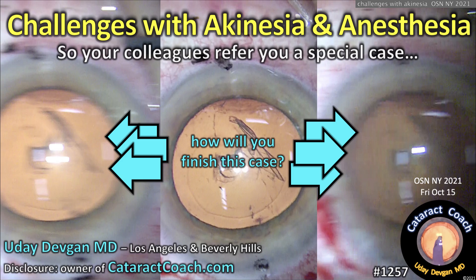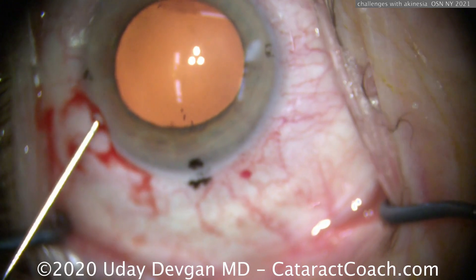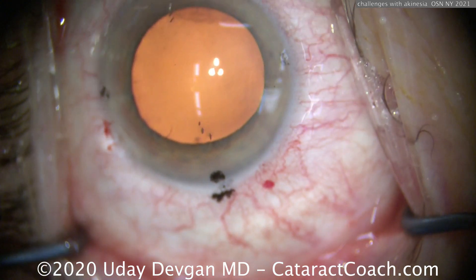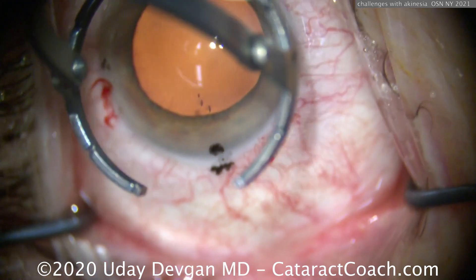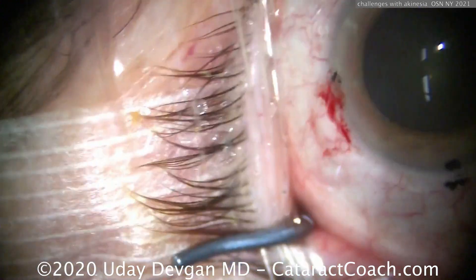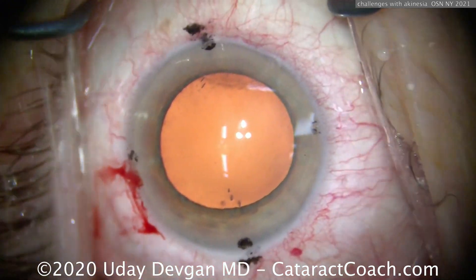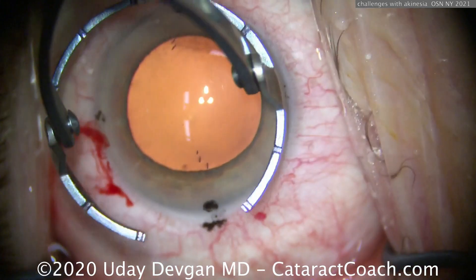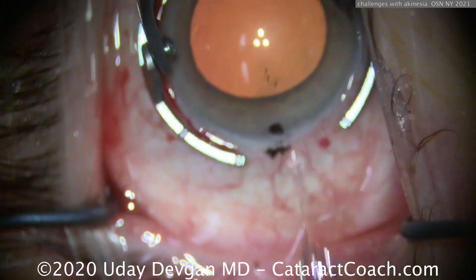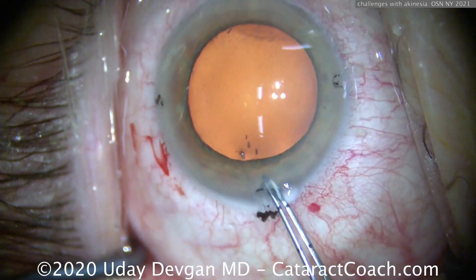cataractcoach.com — challenges with akinesia and anesthesia. Your colleagues refer you a special case. There's a lot of movement. We taped the head, had the assistant hold the patient's head, and considered more sedation — but this patient has significant systemic medical issues. Her internist and cardiologist said we have to give a minimum amount of anesthesia; she won't tolerate more. So what are we going to do? We're going to get into the rhythm of her motions and shakes, keeping a mental track of that rhythm.